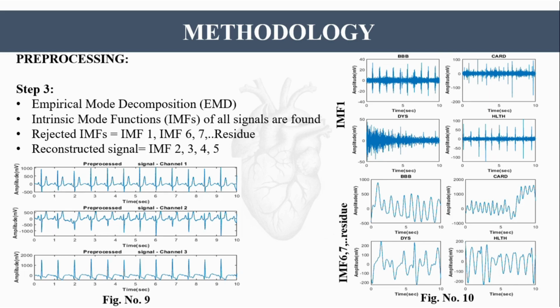In our thorough pattern analysis of the intrinsic mode functions extracted from VCG signals, we have systematically examined each IMF's local characteristics, focusing on the presence of the PQRST complex pattern.